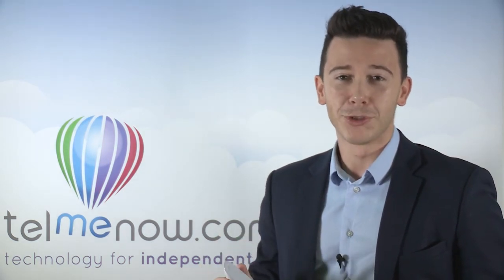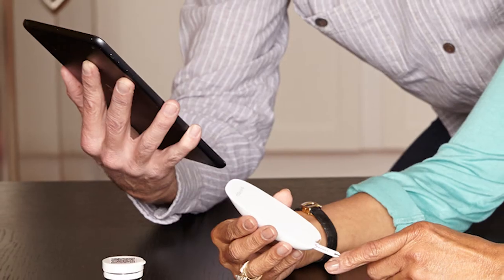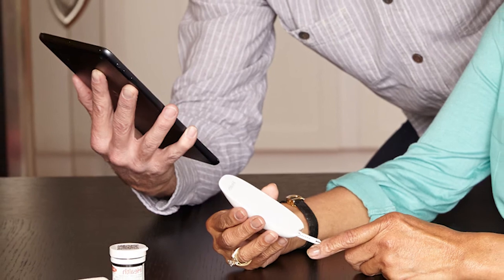You can even share the results with your doctor so they can more accurately adapt your treatment. Most importantly, with FDA approval and CE compliance, you can feel confident that you're getting the most accurate blood glucose results.